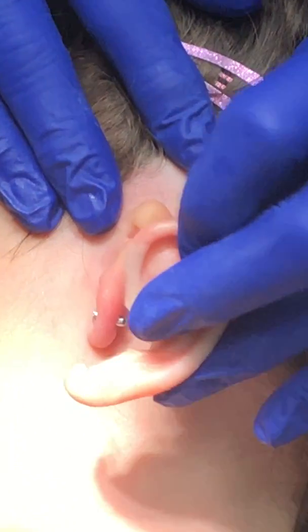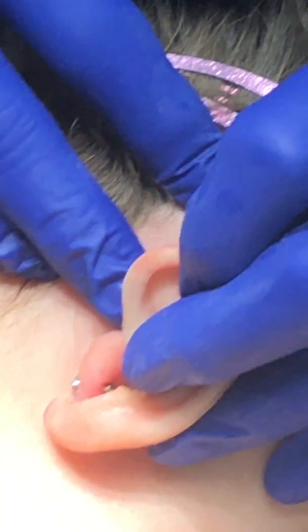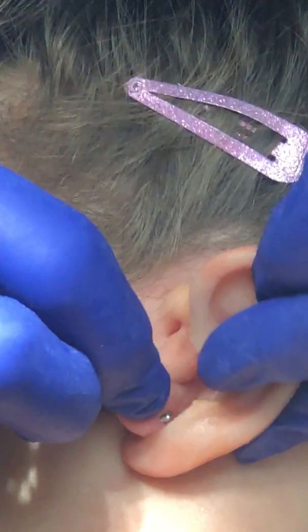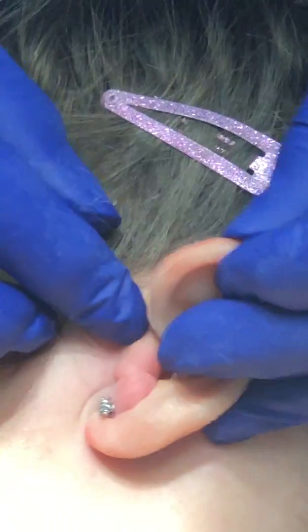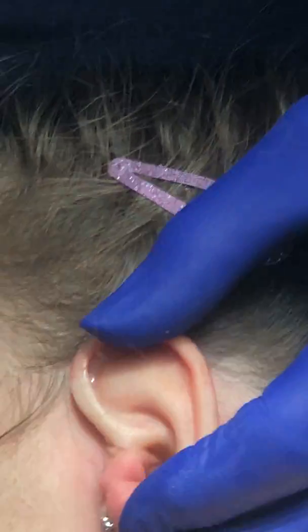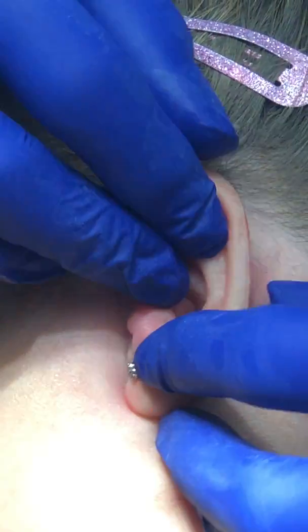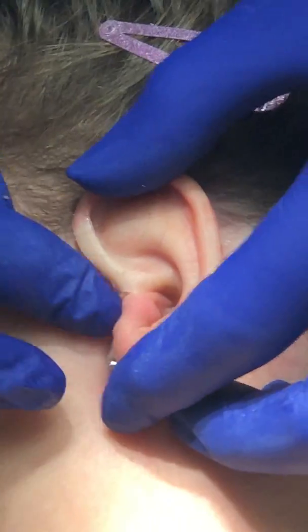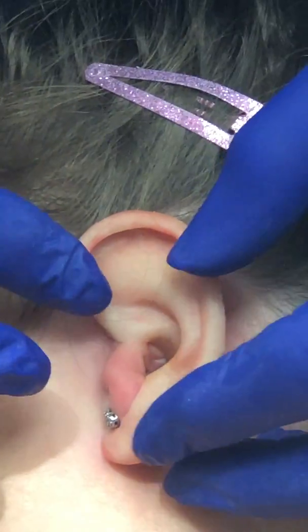The way I place the ear is I like to go from the bottom to the top. And with an earring on, it's a little tricky. Stuff that in there like that, and then get the top of the ear on here like this. Check the back. Hold it in place for a little bit.